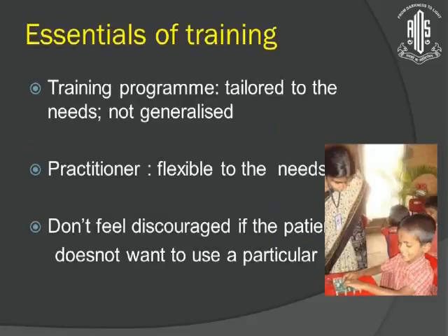The training program has to be tailored to the needs of the patient, not generalized. For example, two children of the same age with the same visual acuities may not benefit from the same visual aid because their needs and expectations may be different, and the practitioner has to be flexible to the needs of the user. Don't feel discouraged if the patient doesn't want to use a particular low vision aid. This is very common. After explaining all the low vision aids in detail, the patient often tells you, "No, ma'am, I don't want a low vision aid." But our experience is that most of the children or adults do return after a few weeks, and they ask you, "Please give me the low vision aid, I think I am better off with it."